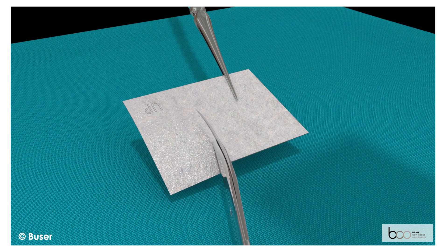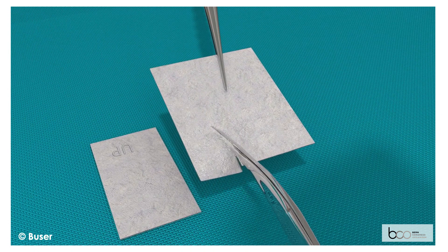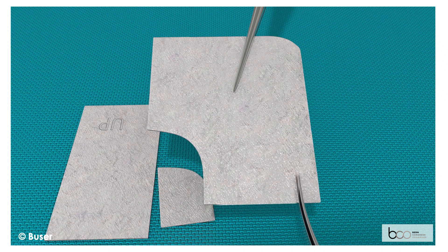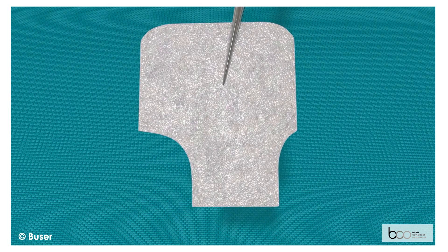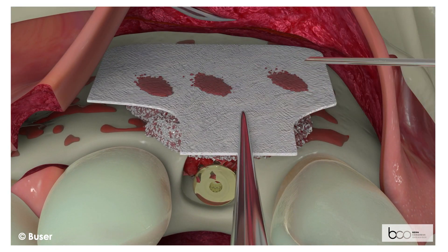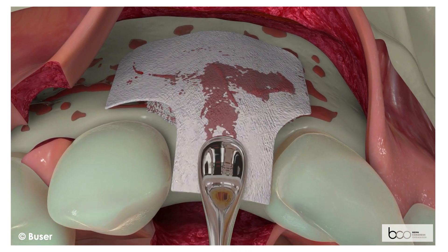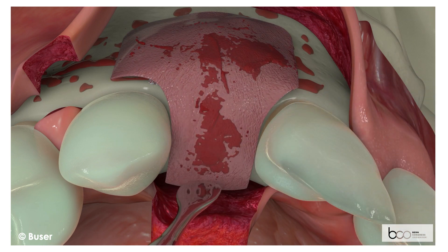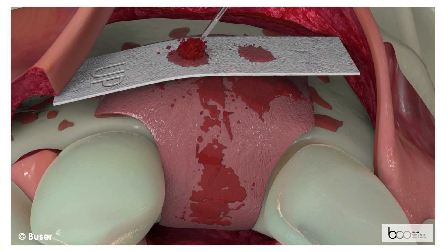A critical step for a GBR procedure is the utilization of a barrier membrane. A collagen membrane is cut into two pieces, a larger and a smaller one, and trimmed to shape. Collagen membranes offer several advantages: they are easy to apply when soaked with blood, and when moistened with bone-conditioned medium the membrane becomes soft and adhesive and can be easily adapted to the local bone anatomy. The second membrane strip improves the membrane thickness in the defect area and improves the stability of the membrane.